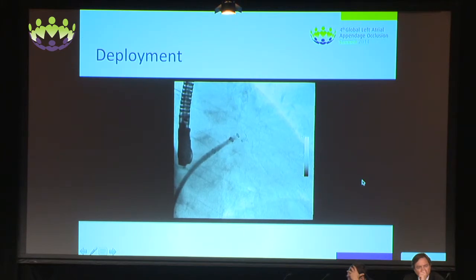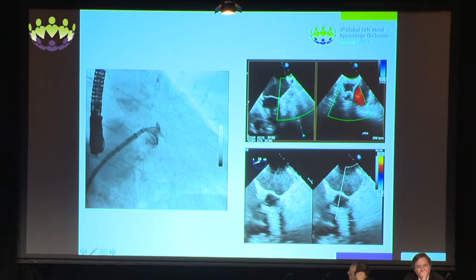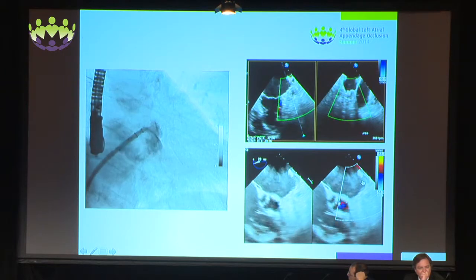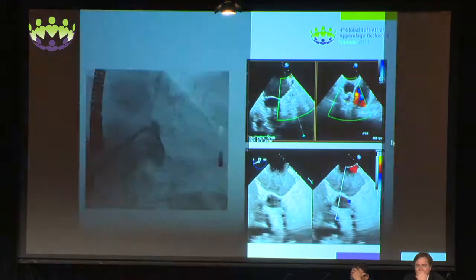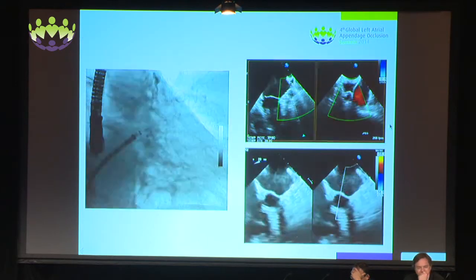So with this little rotation, we get a very nice final result with complete or almost complete coverage of all the appendage. Here you can see in the 135 that the device has rotated a little bit, and with this rotation it was able to occlude completely the appendage.